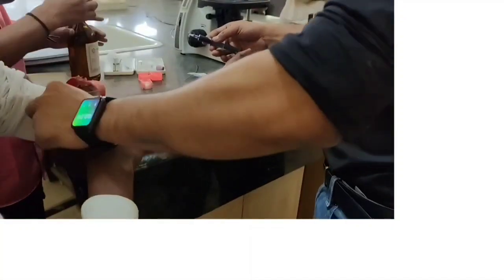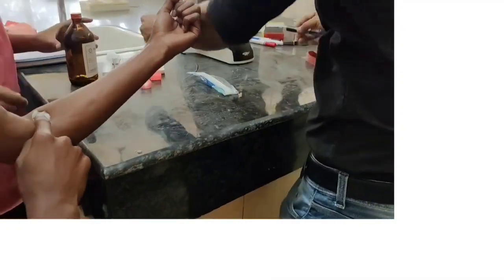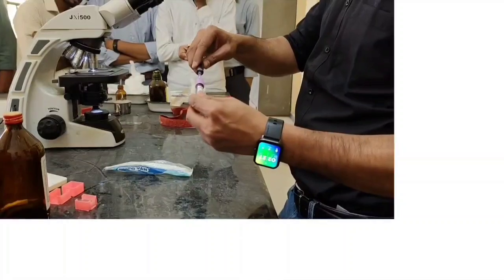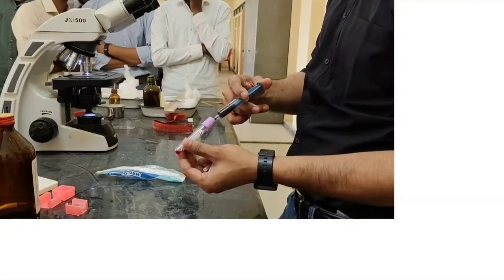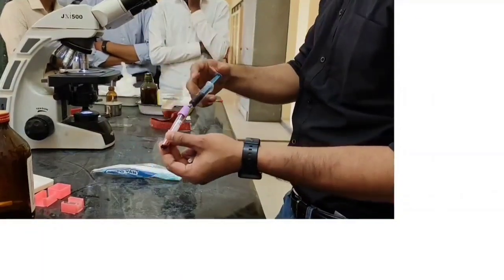Now we should open the tourniquet and put this blood into the vial. So this vial actually contains anticoagulant to prevent clotting, and here we should be very careful to transfer the blood from the syringe to the vial slowly.